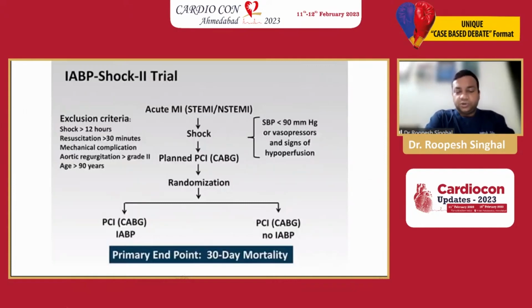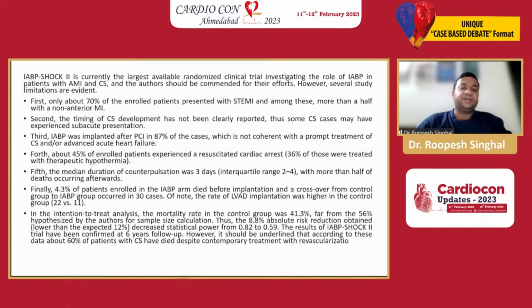again, though this does not compare devices, this was the study which drove IABP out of fashion. They had around 600 patients and classified them to IABP versus no IABP. But though a lot of talk is based around the IABP-SHOCK II trial, the study had its limitations. Firstly, only 70% of the enrolled patients presented with STEMI, and among these, more than half had a non-anterior myocardial infarction.